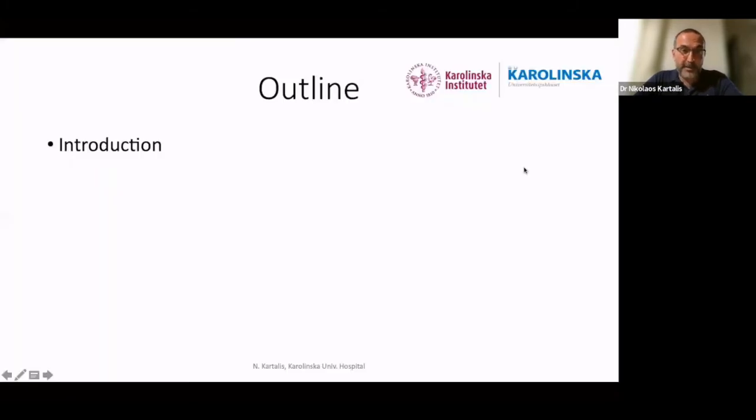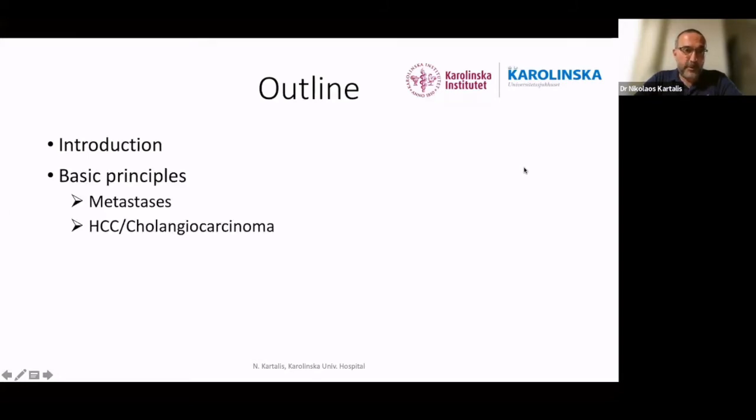In order to do that, I will start with a short introduction, how I look at the cases. We'll go through the basic principles of the malignant tumors, metastasis and the primary ones, the HCC and cholangiocarcinomas, how we see them on imaging. Then we will discuss some interactive cases on the platform of CMRAD, and then I will point out some pitfalls that you need to remember during the talk. And then I will finalize with a take-home message.